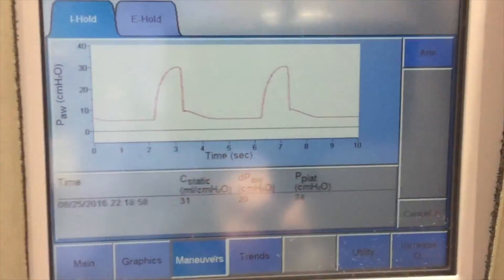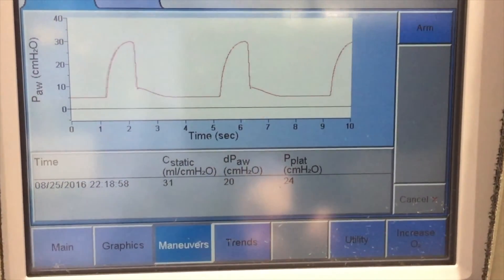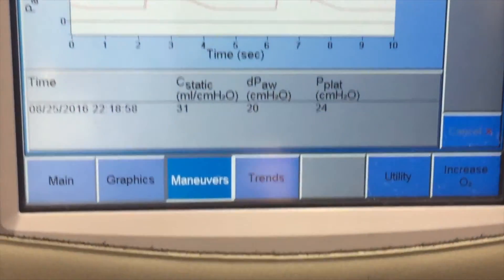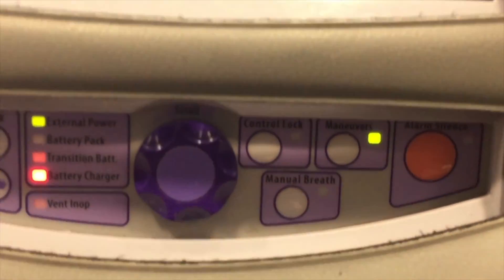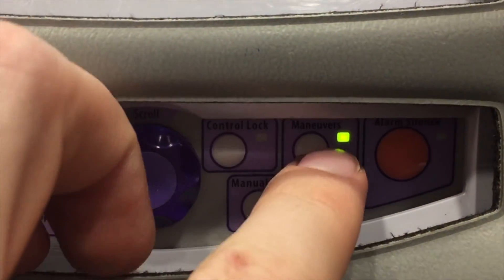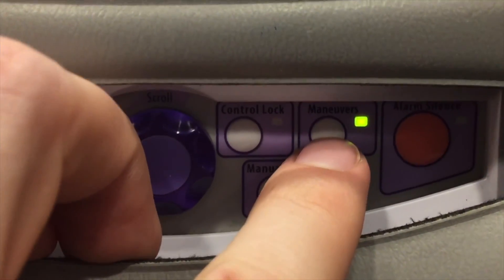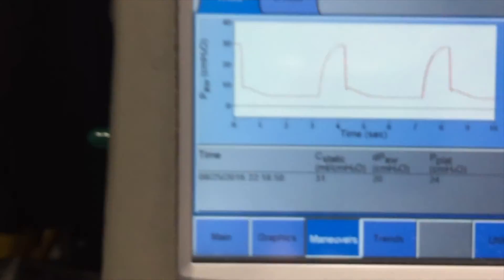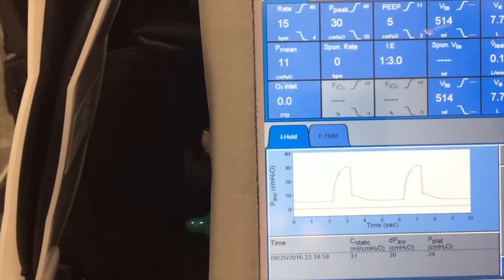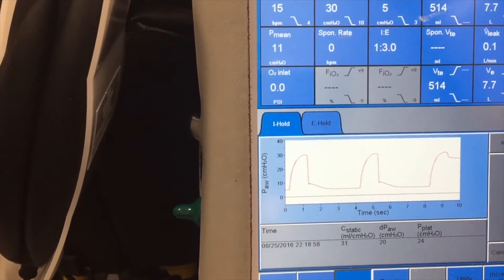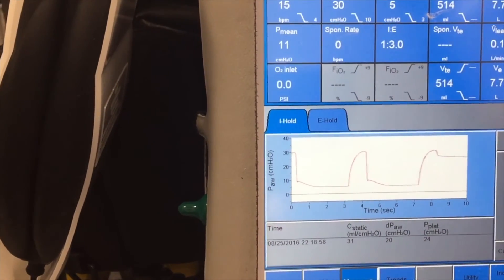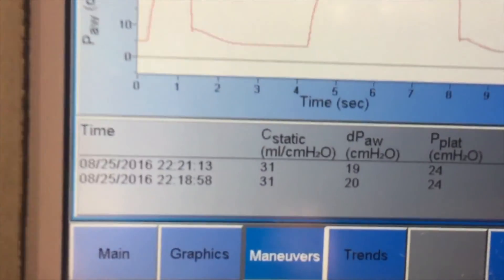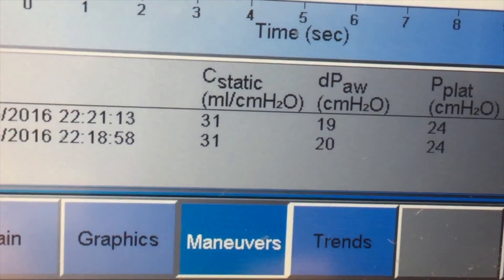We're already in the maneuvers screen, and over on the right side it says Arm — so we'll hit Arm. Then this other Maneuvers button starts blinking, so you can start pressing it at any time. It'll hold the next breath. I'm starting to hold it right now. The next breath goes in, it holds it — you can see it on the screen there. And there is our plateau pressure.